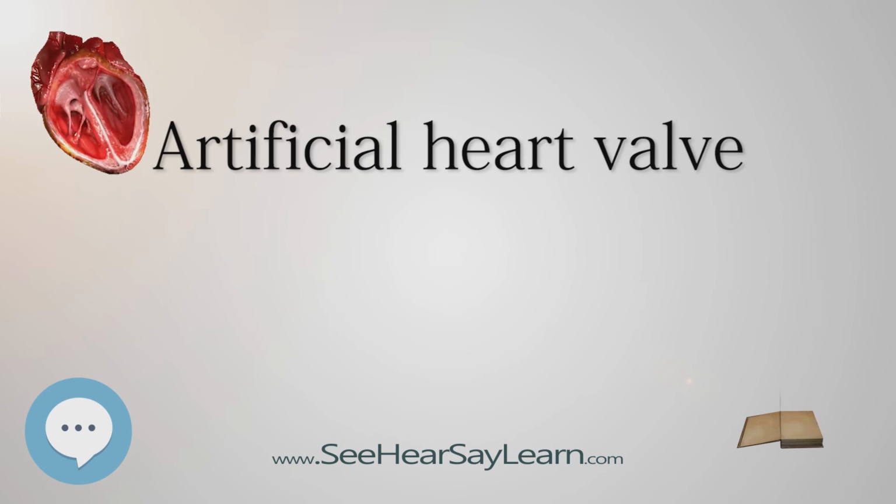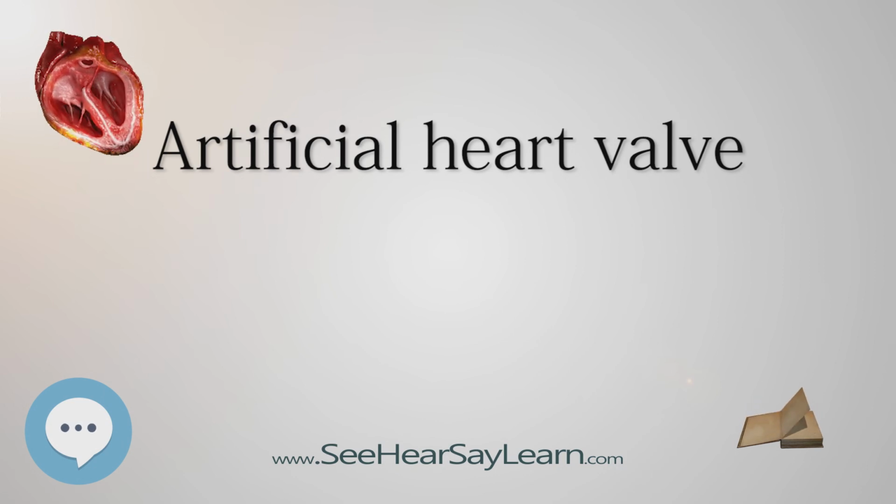The bileaflet is more adaptable to this problem than the tilting disc model because if one leaflet stops working, the other can still function. However, if the hinge is blocked, both leaflets will stop functioning. Because all models experience high stresses, patients with mechanical heart valve implants require anticoagulation therapy.